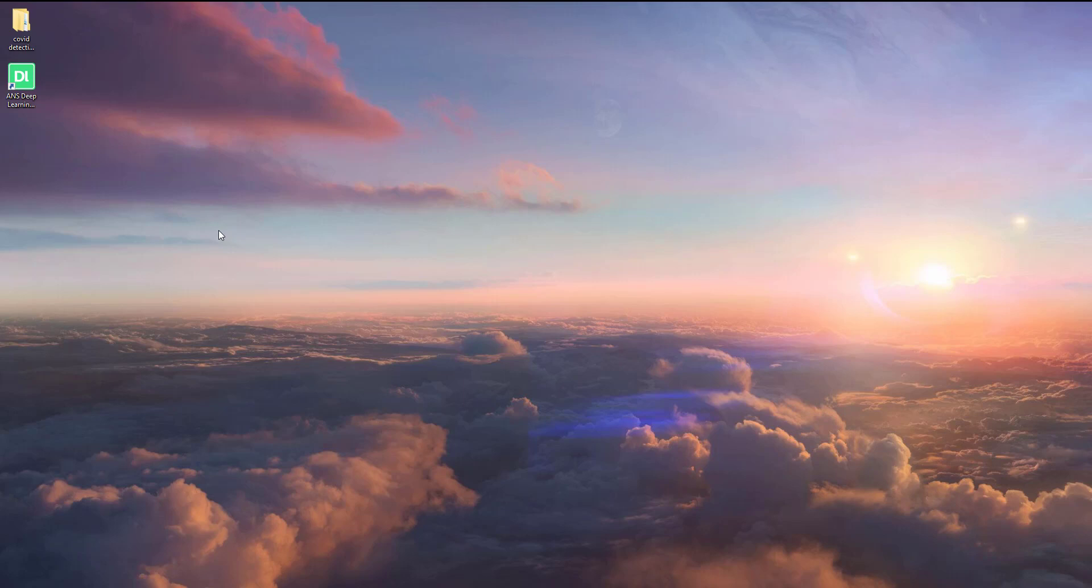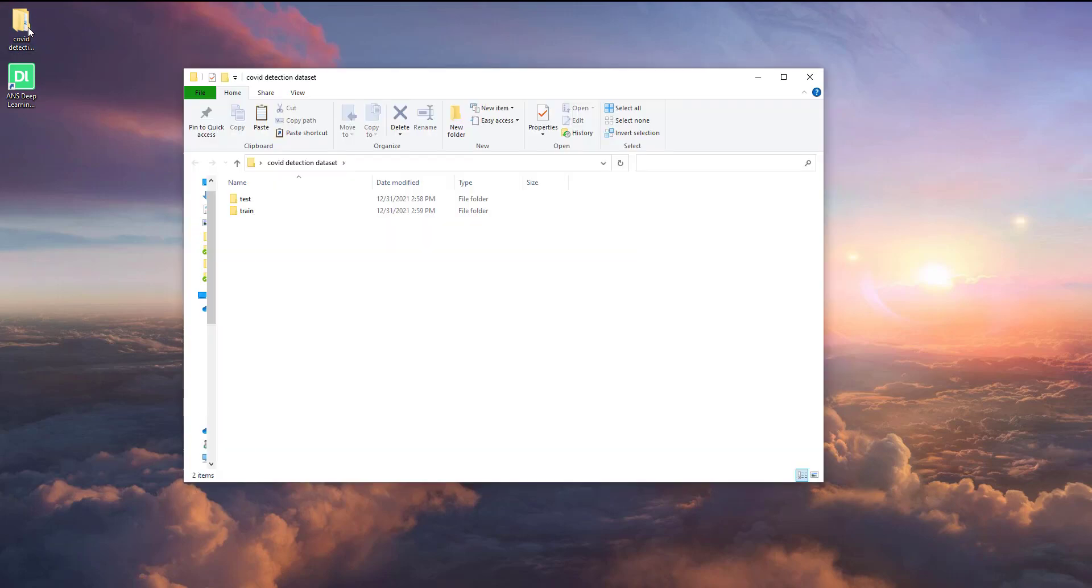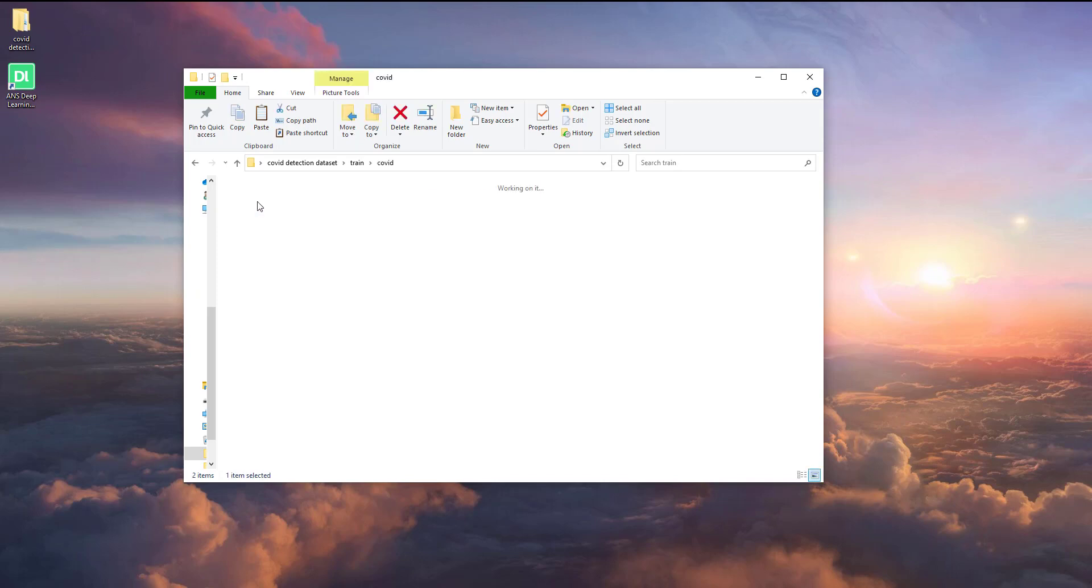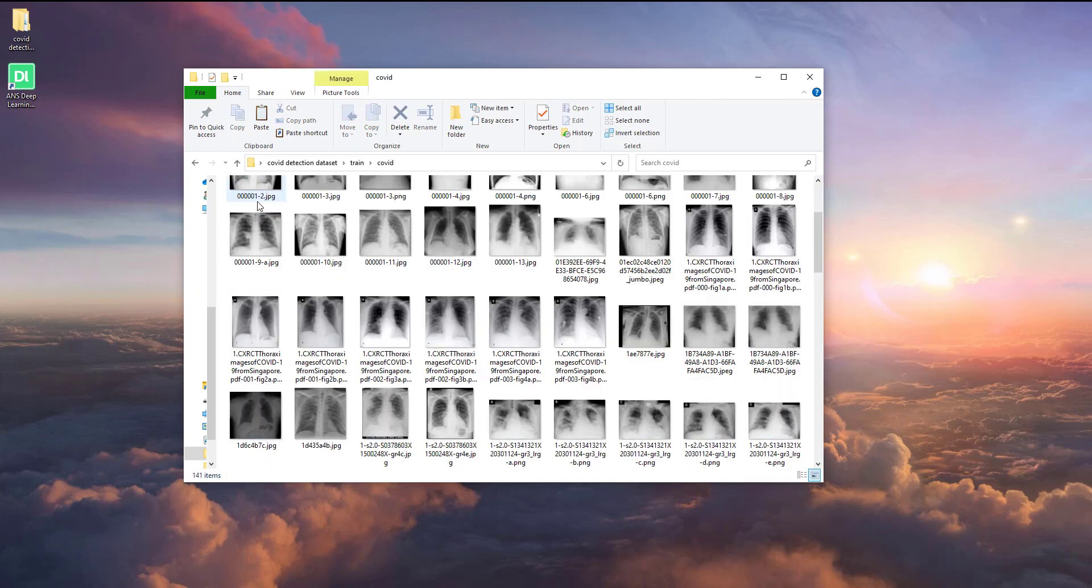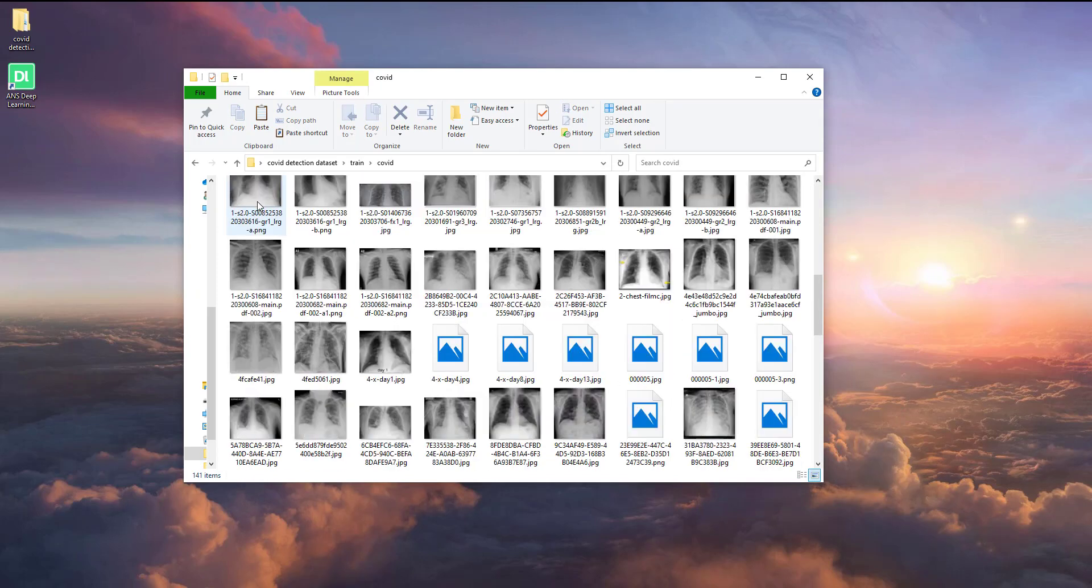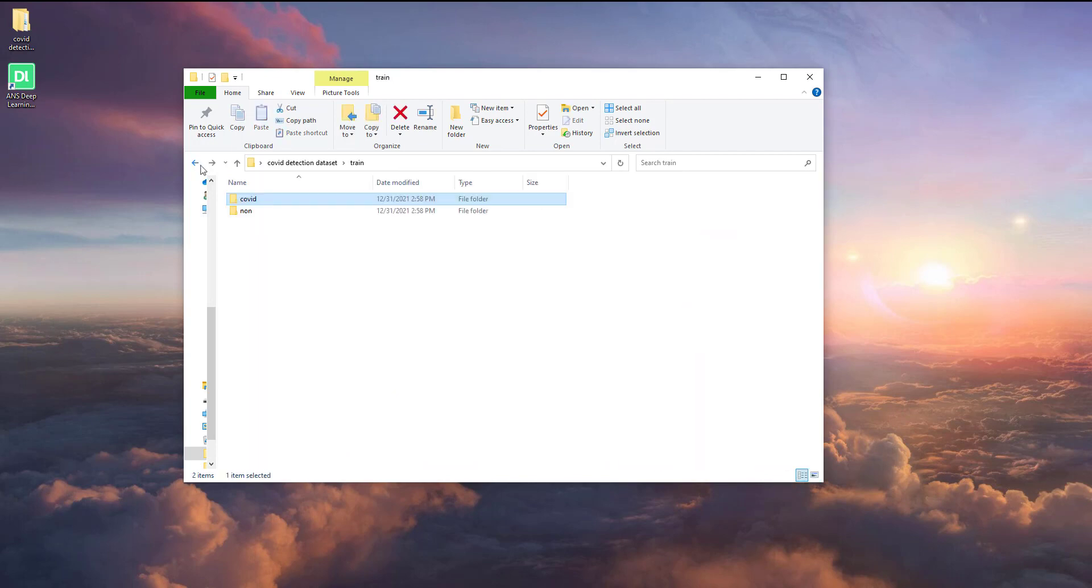First, we'll need DL Hub software installed on your PC and a training dataset. The training dataset includes two folders named COVID and non. Each folder contains many categorized chest X-ray images with COVID and non-COVID symptoms.